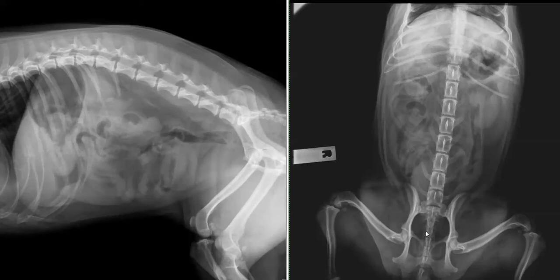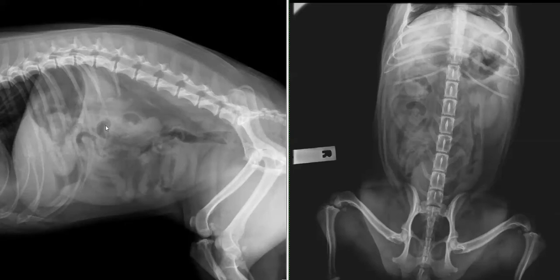The next thing I interpret is the colon. The colon runs from the pelvic canal — the descending colon runs up the left body wall, the transverse colon runs transversely caudal to the stomach, and then the ascending colon runs down the right body wall, ending in a curly squiggle which is the cecum. On the lateral projection we can see the cecum, and it often looks sigmoidal or corkscrew shaped filled with gas, and that's normal. The colon sometimes contains faeces or gas, which we can see as a stippled pattern. The colon on the ventrodorsal projection has a shape like a question mark, but on the lateral it's a bit more variable.